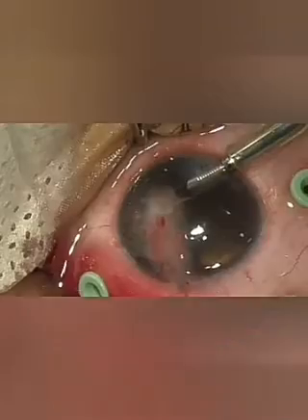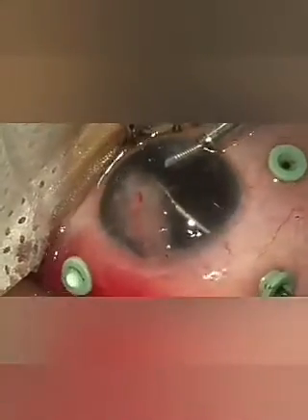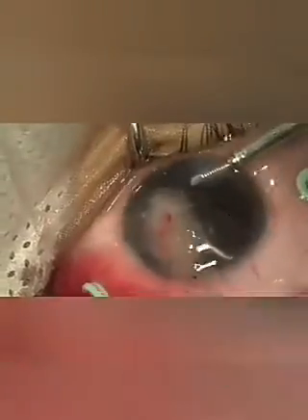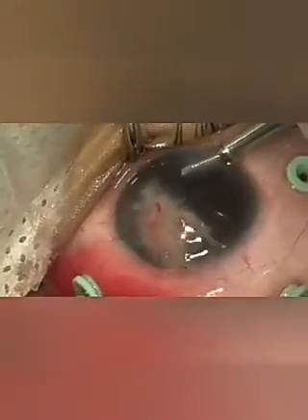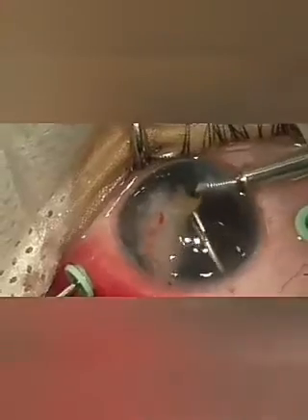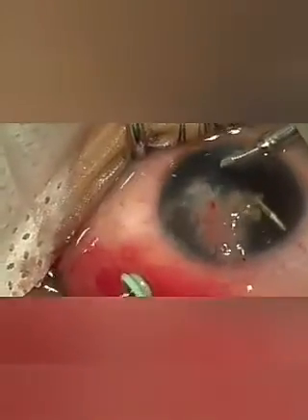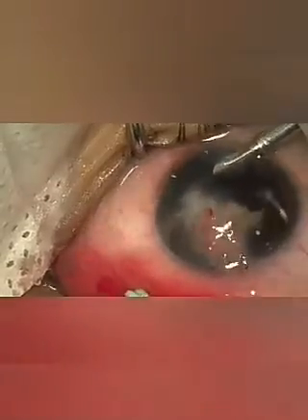balanced salt solution. Collapse of the anterior chamber space can potentially result in endothelial cell damage, and iris tissue damage with secondary bleeding into the anterior chamber. With a collapsed AC, it is difficult to remove pigment residues and lens material from the AC.